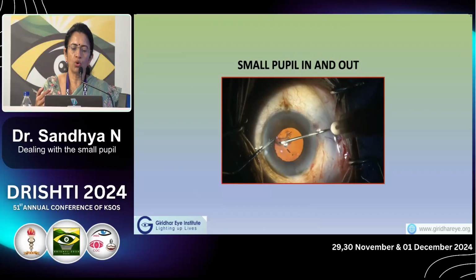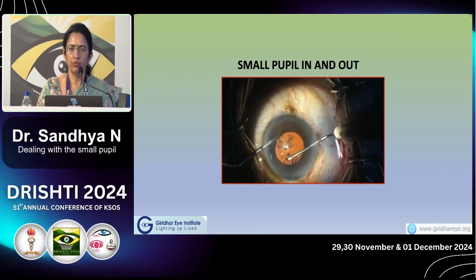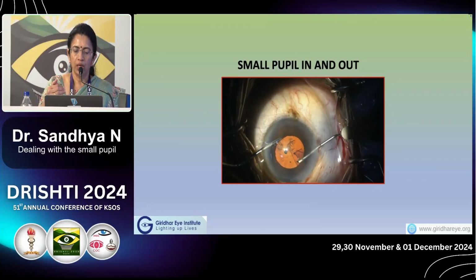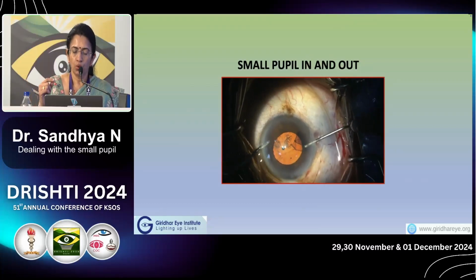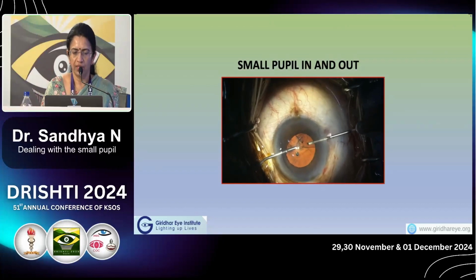Here 2 to 3 strokes of the rhexis can be taken out, and then you have to bring the apex of the rhexis within the pupillary area, and then again take 2 to 3 strokes outside and then bring it within the pupillary area. We should always bring the apex within the pupillary area in between, because with continued force outwards, the rhexis can extend to the periphery. This should not be attempted if the pupil is very small, if the lens is intumescent, and also if there are features of IFIS.